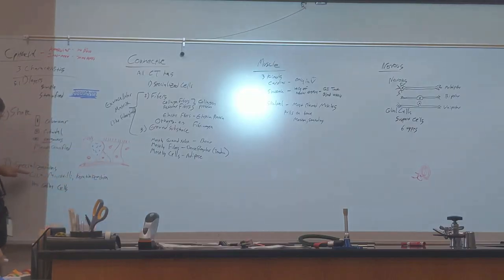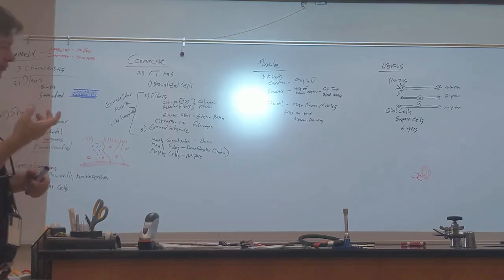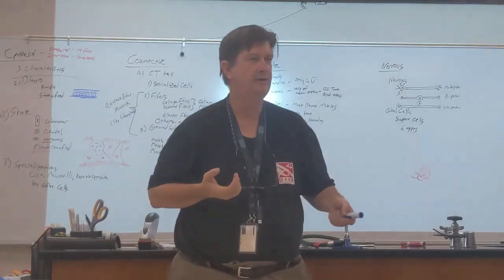All right, so one of the specializations you have is cilia, one of them you have is microvilli, one of them is goblet cells. Let's do one more. This is stratified squamous. We'll talk about it in a minute. Would you agree a scratch on the inside of your cheek is a lot worse than a scratch here? Why is a scratch on the outside not so bad?